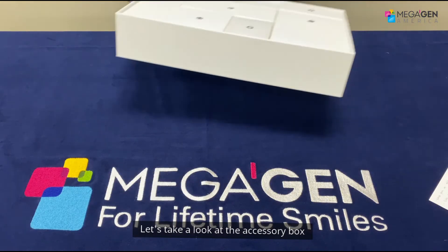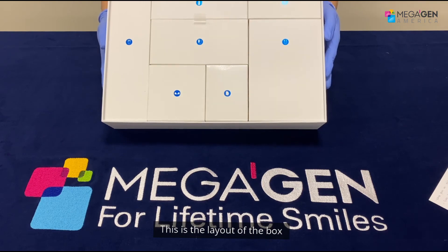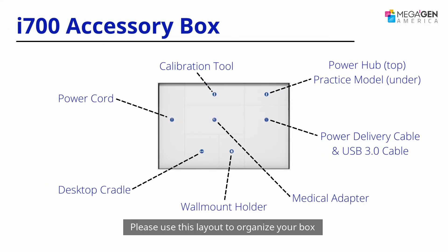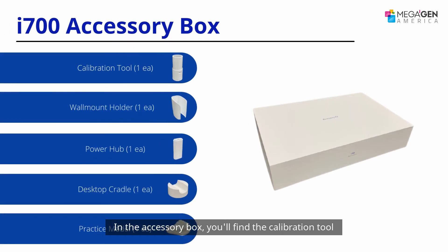Let's take a look at the accessory box. This is the layout of the box — please use this layout to organize your box in case you send your scanner for replacement or fixing. In the accessory box you'll find the calibration tool. Calibrate your scanner every week or two to stabilize the accuracy.